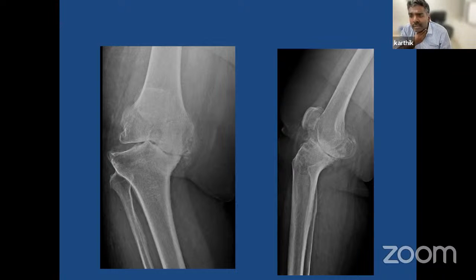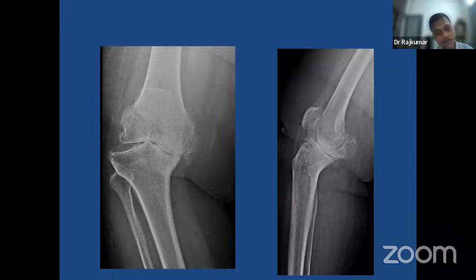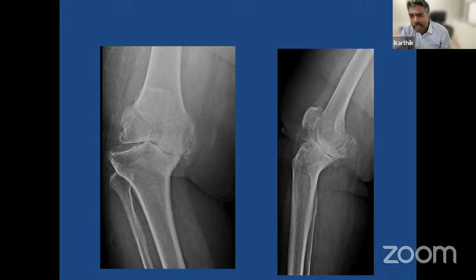See, in severe varus cases, after all the medial release and sometimes even the medial epicondylar release, you find that there is some residual lateral laxity. Have you seen that? How do you address it? Do you go and tighten the lateral side, or do you just keep on increasing the insert size, or do you go for increased constraint? How do you decide on that?